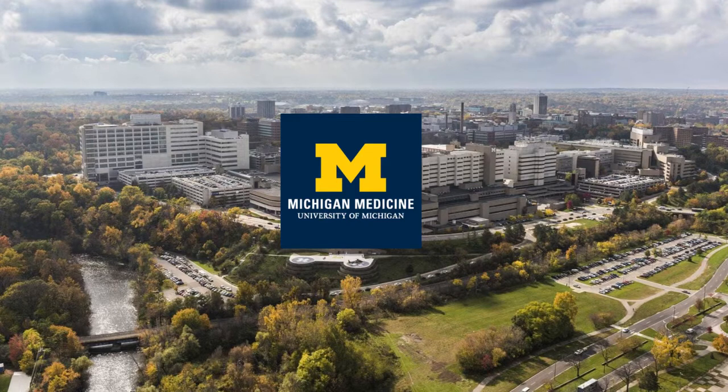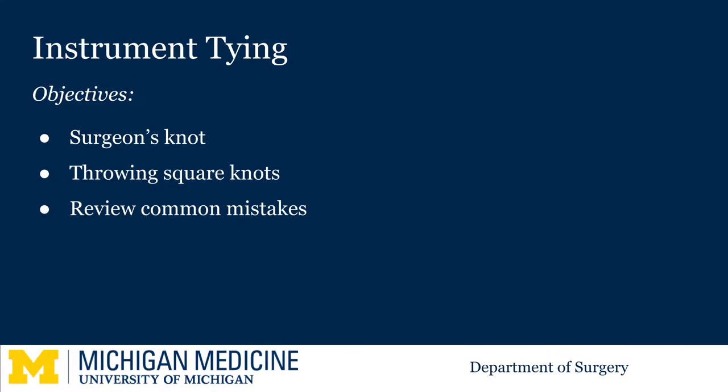Welcome to the University of Michigan micro learning program for the surgical clerkship. Today we will show you how to instrument tie. The first throw is called a surgeon's knot while subsequent throws are square knots. At the end we'll review some common mistakes.